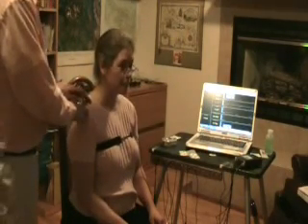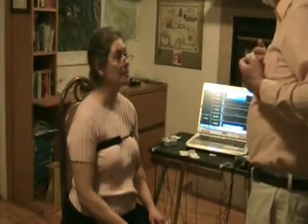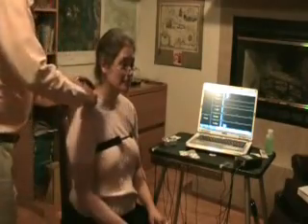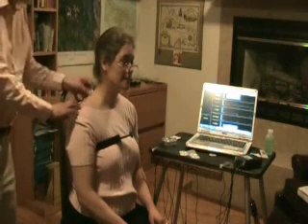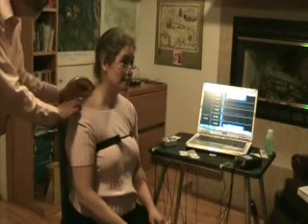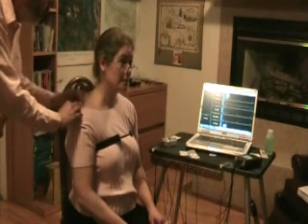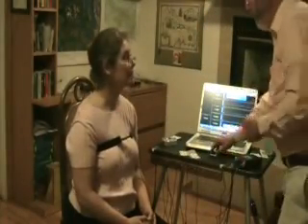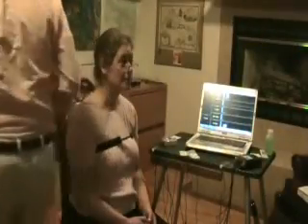Okay. I'm recording from your right shoulder because the heart is on the left side more, and it produces a giant electrical artifact. So if we record from the right, we'll get less of an artifact. And again, we're not looking for pain here. We're looking for responses to stress, emotional responses. And we're not particularly recording from the shoulder muscles, the upper trapezius. We're trying to pick up general muscle responses in the whole area. So I'm recording from a whole series of muscles. So in both cases, we're recording incorrectly if we were trying to pick up what an individual muscle is doing. Instead, we're going to be picking up general activity in an area.